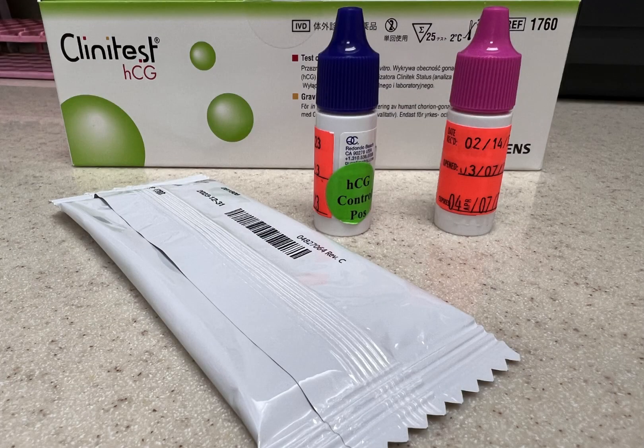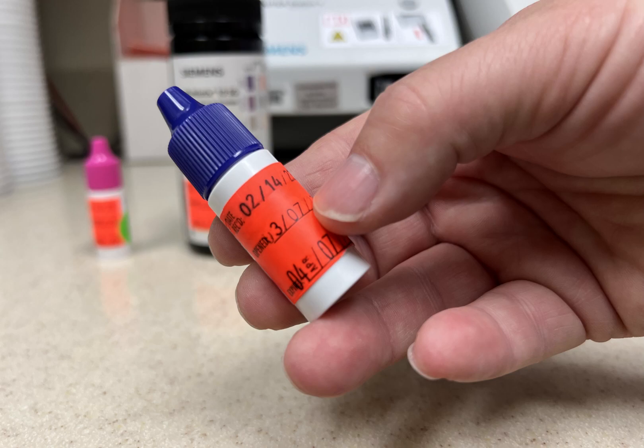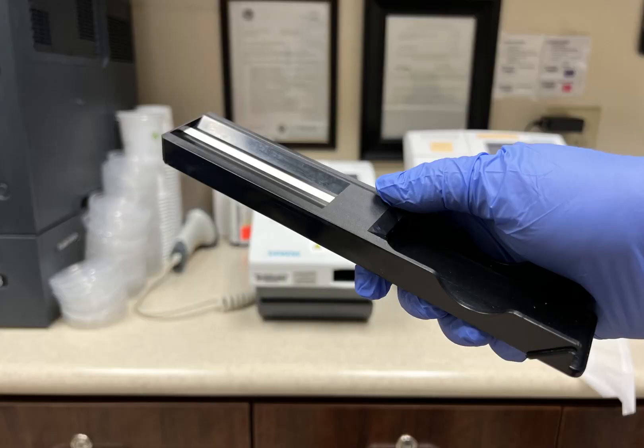How to QC the HCG cassette. It is very important to check the expiration date on the cassette and the controls. Use the purple control for positive and the pink control for negative. Clean the bridge before performing an HCG.